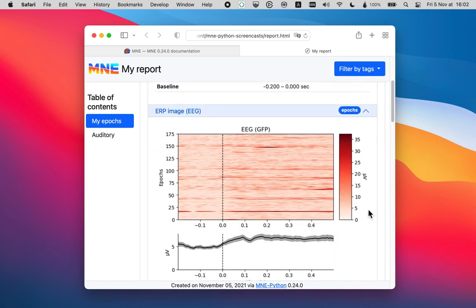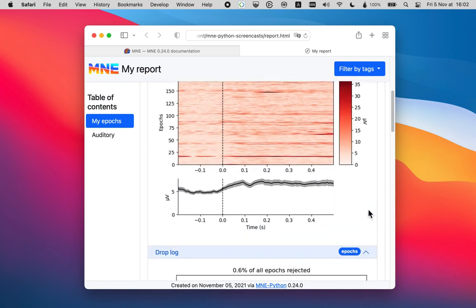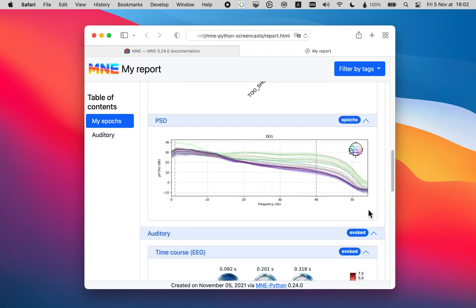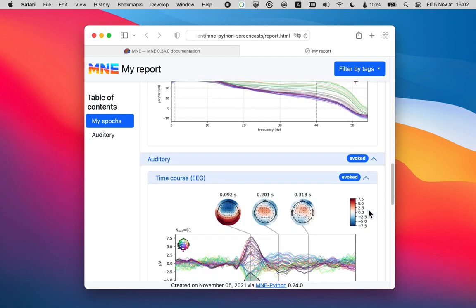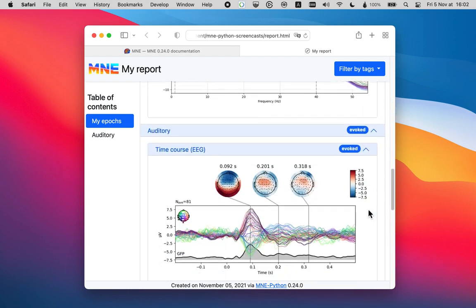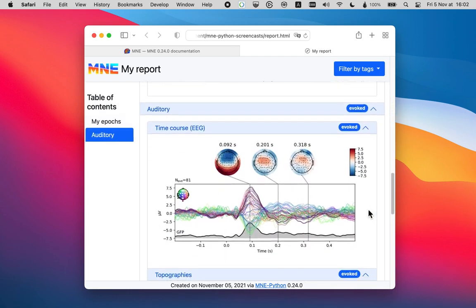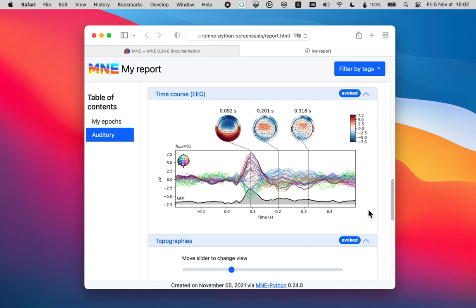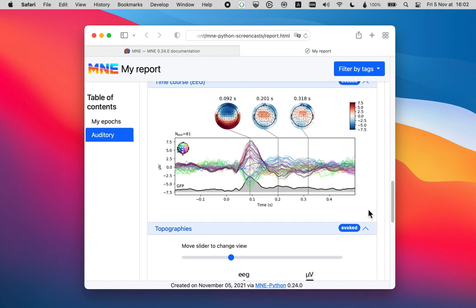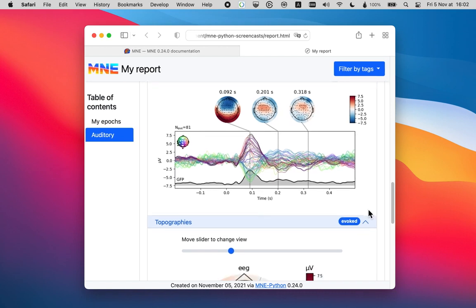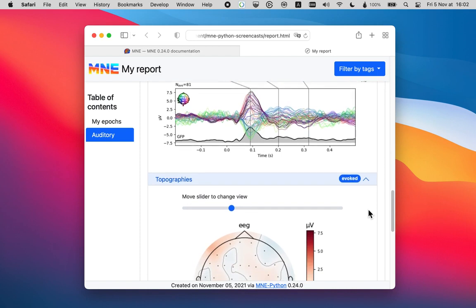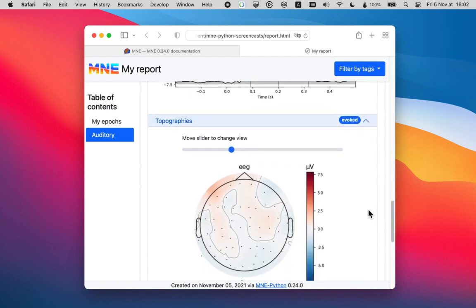Looks good. We have an ERP image here. Very nice. And down here, we have our evoked object. This is the auditory data that we generated.